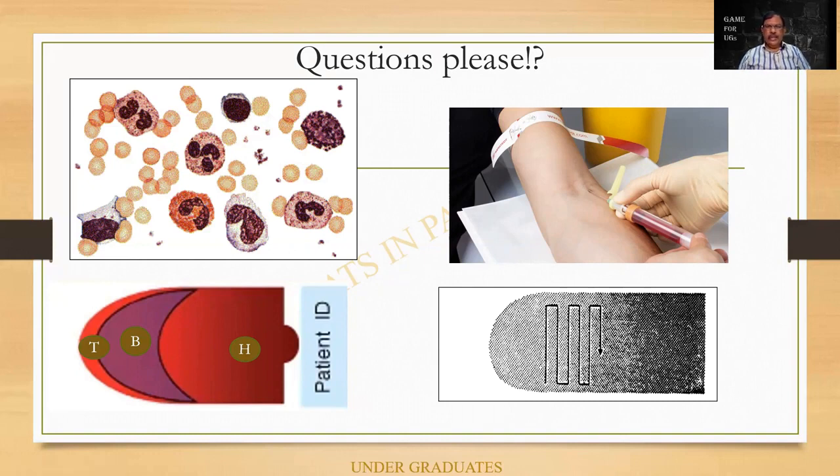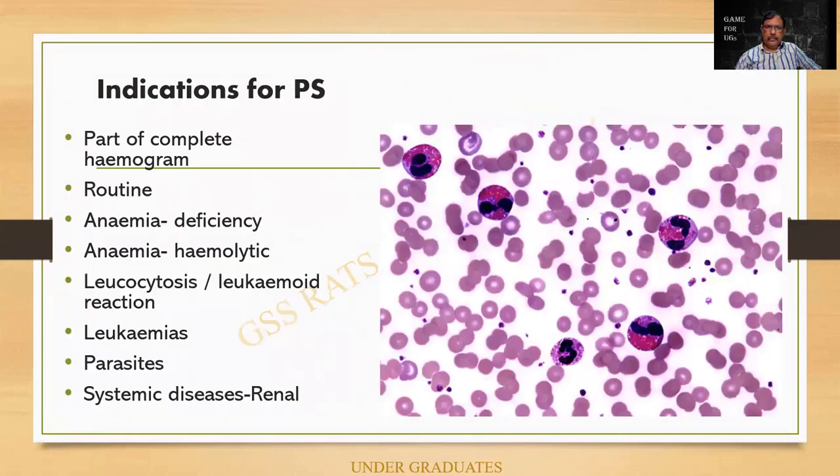So this particular slide shows you how much can be learned and answered in a peripheral smear. Please look at this slide very carefully. Before I complete the list over here, I would like you people to kindly make a diagnosis of what you people see.